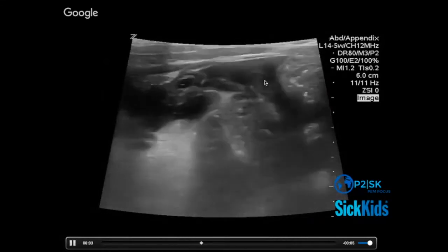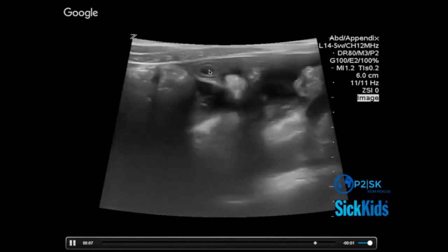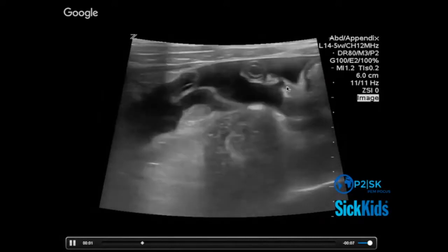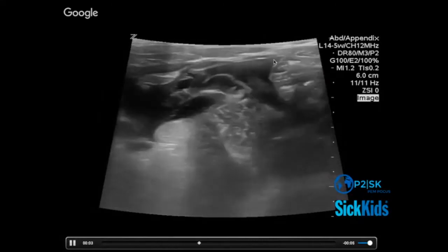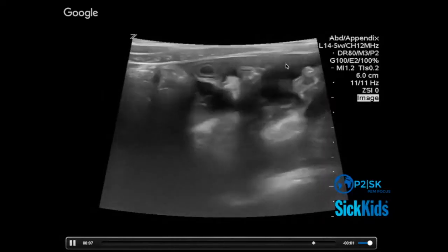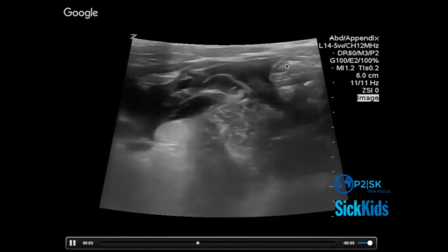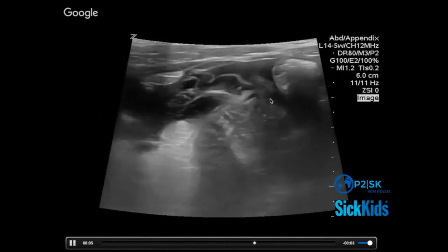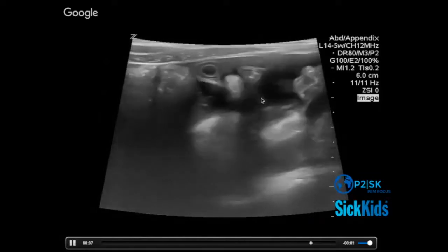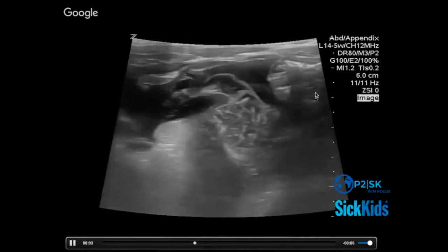So people are probably seeing the clear target here. Swimming in free fluid, right? Is that free fluid clear or is it turbid? And maybe there's a little bit of turbidity, but I think a lot of that's just, yeah, then down here we're getting back into bowel.